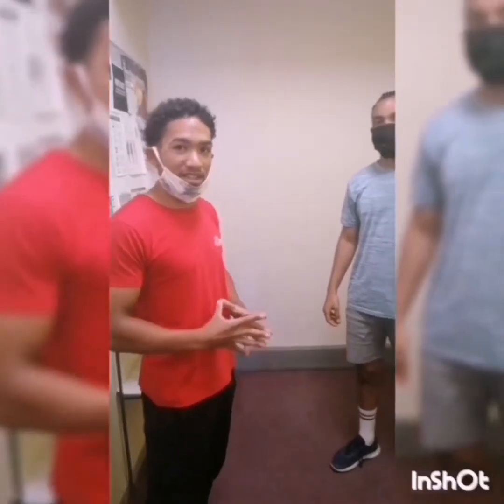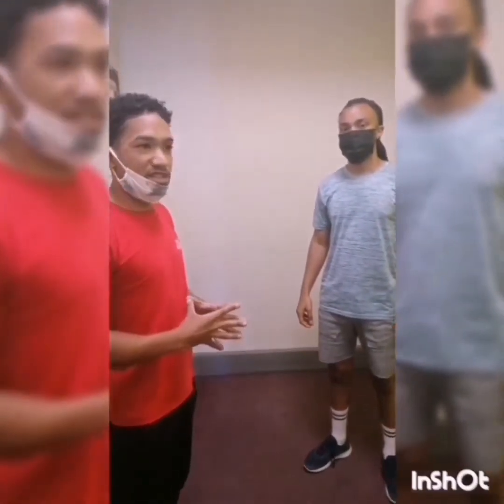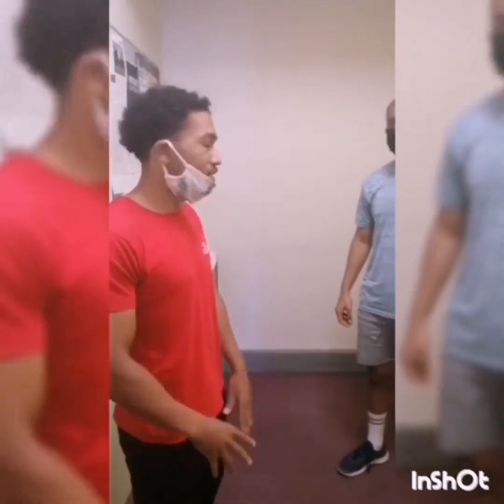And this is my client Dylan Klassen, and we're going to assess the physical evaluation. We're going to start out by taking his blood pressure first.